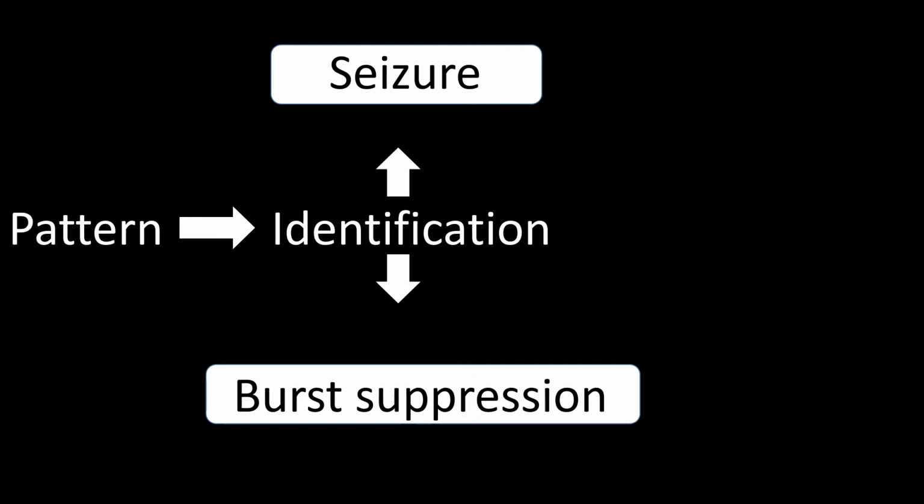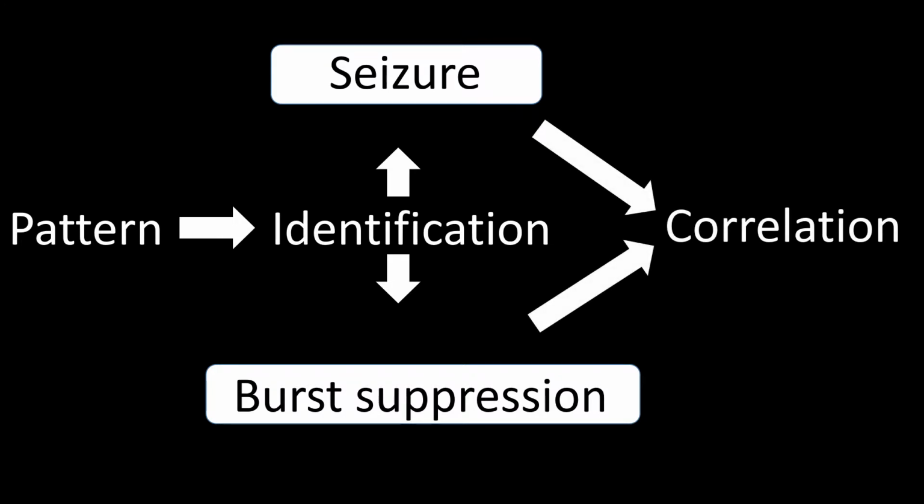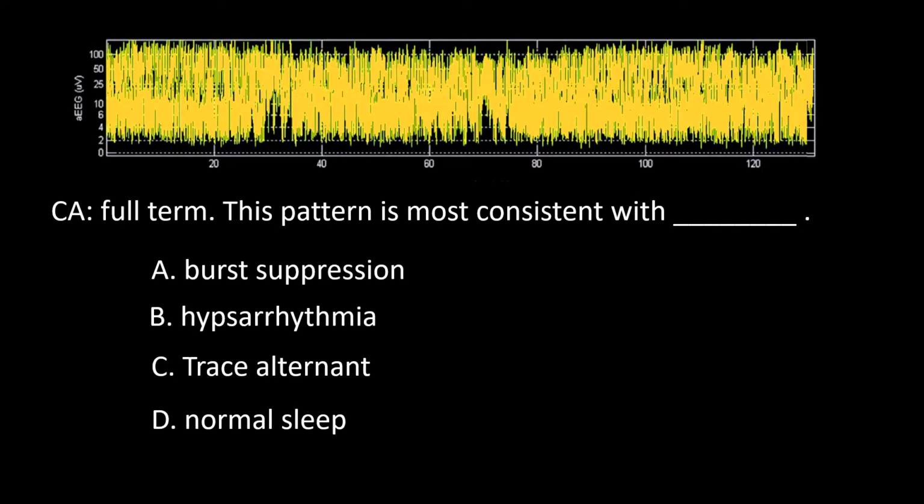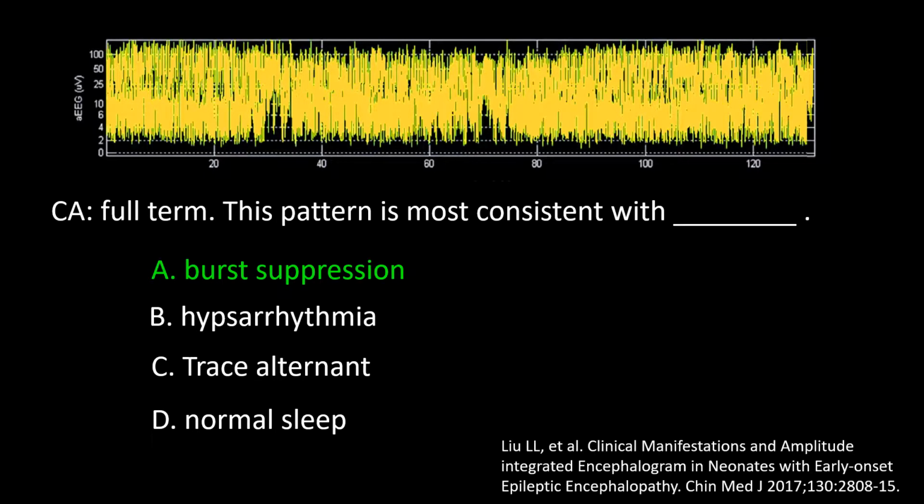The next step is to correlate these findings with conventional EEG and clinical impression. So the answer to this question is A.